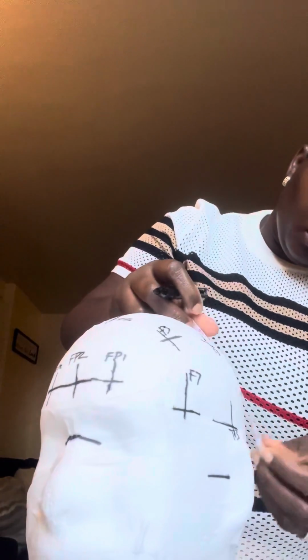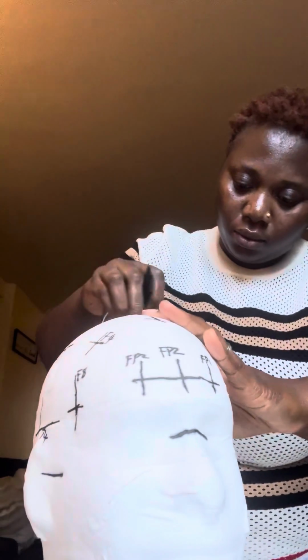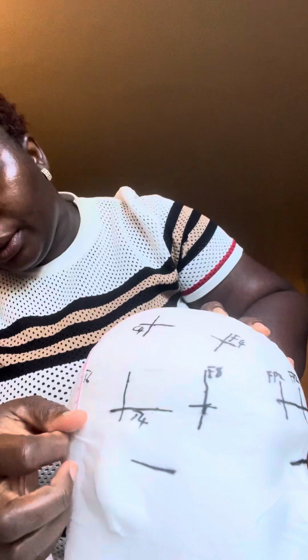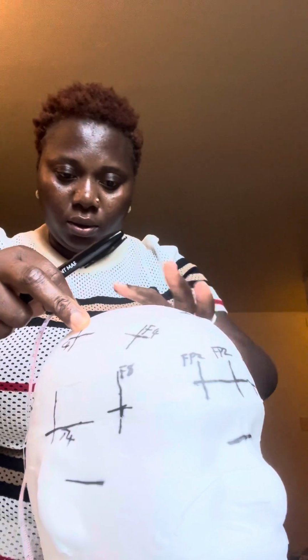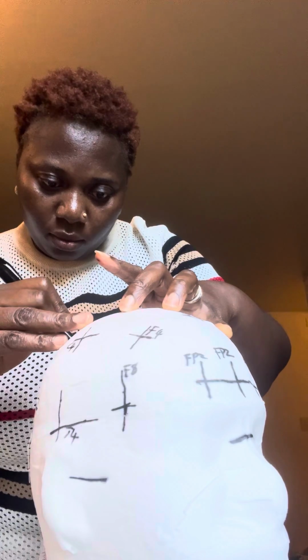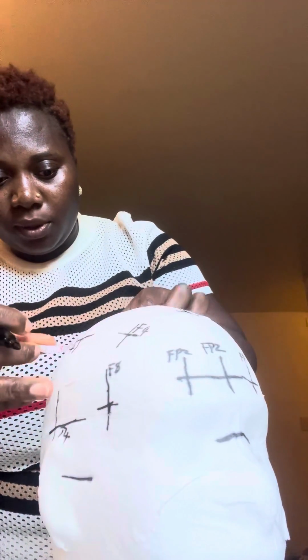I will do the same thing for the posterior corona, 23 divided by 4, which is 5. P3 to PZ, PZ to P4.